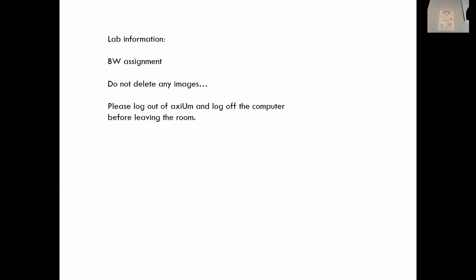I just want to take a second to say these things since they're on this slide, which I forgot they were on. When you start taking films in clinic on Dexter, when you pull up a template and you have like 4 x-rays or an FMX, if you take your 4 films and you want to try again because one of them didn't turn out good, you can take more, but don't ever delete films that you don't like. They'll just live in that bottom scrolling part. It's fine if you have 4 of them down there or 5 of them or 2 or whatever, but never delete a film because that's part of safety for our patients.